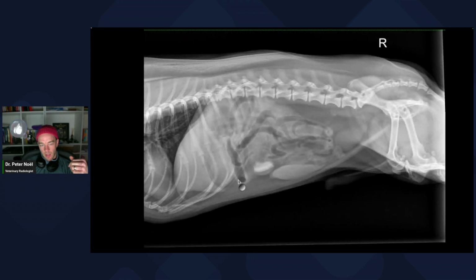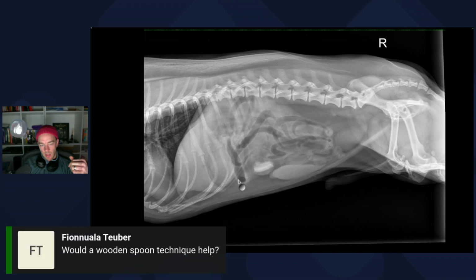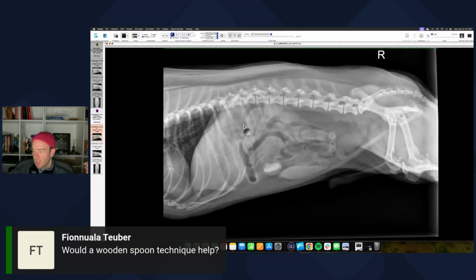And yeah, you could do a wooden spoon. Absolutely. That's a great guess. For those of you that don't know wooden spoon technique, I love it. I love this wooden spoon. You take a wooden spatula and you compress it on the area of interest while obtaining the radiograph. So you could literally flop this thing down right on here, push kind of hard. What it does is it displaces everything out of the way, and then you fire the radiograph, and that should help you as well. Maybe easier than finding one of those interns to blow gas up this dog's rectum.